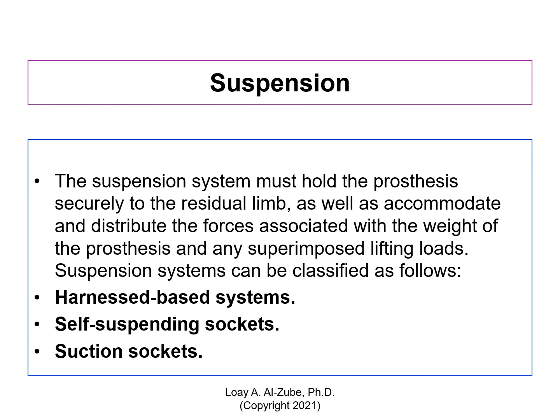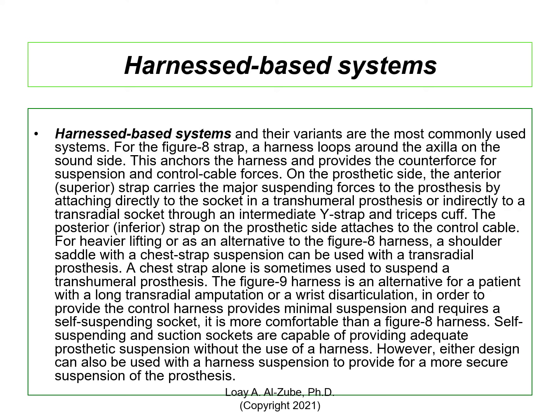More information about the socket and what people are actually using to include these. And then you have the suspension, which is in order to hold the prosthetic with the body. So harness-based systems, self-suspension sockets, or suction sockets, similar to the lower extremity when we use negative pressures. Okay, harness-based system.